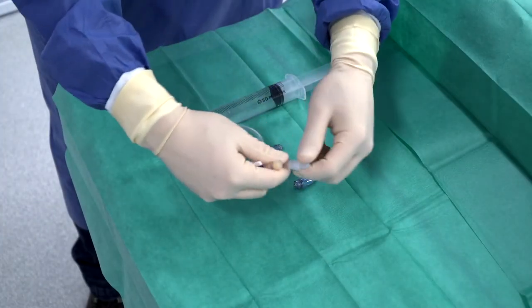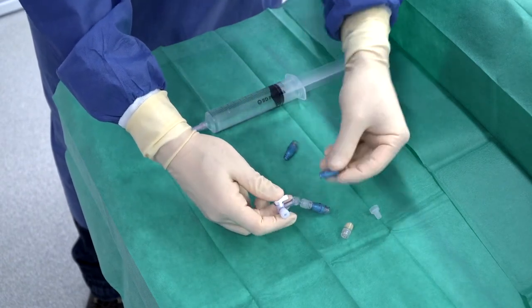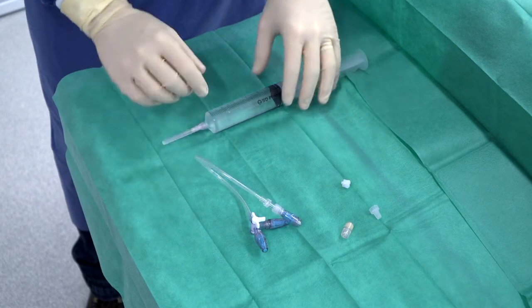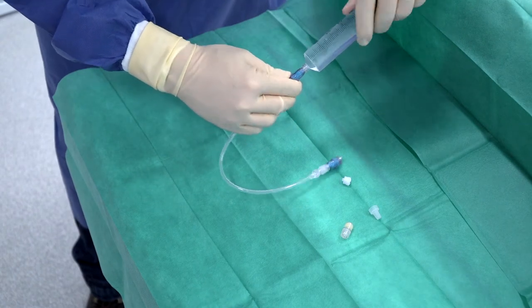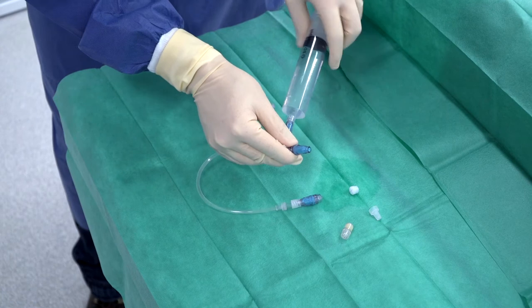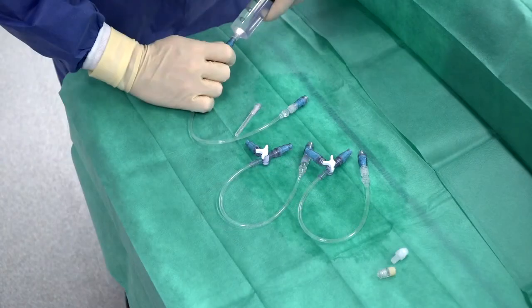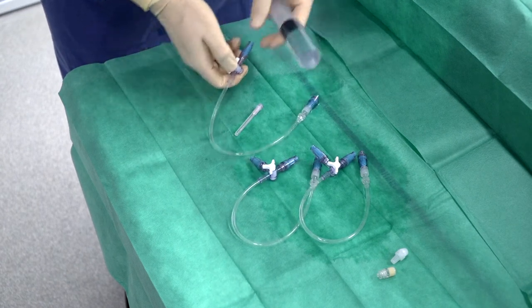We are going to show you how to connect with each socket of the three-way extension stopcock and screw one connector into the end of the extension line, then purge the connectors with sterile saline serum. Each connector should be purged. Then reproduce the procedure three times.